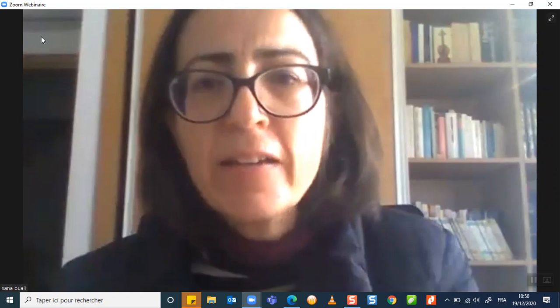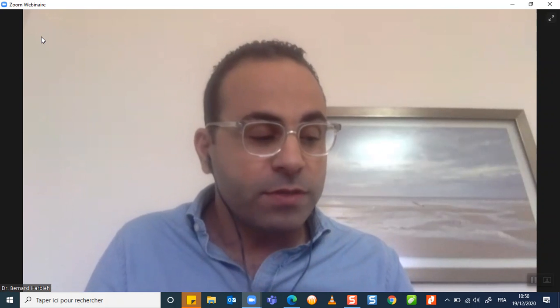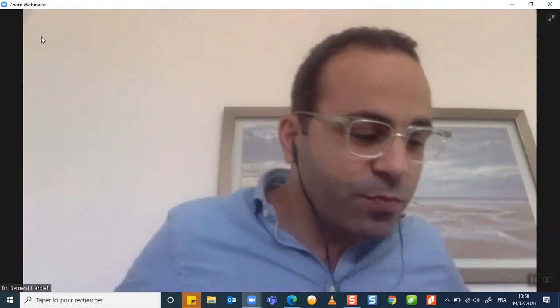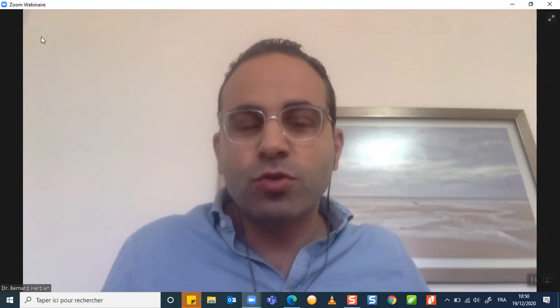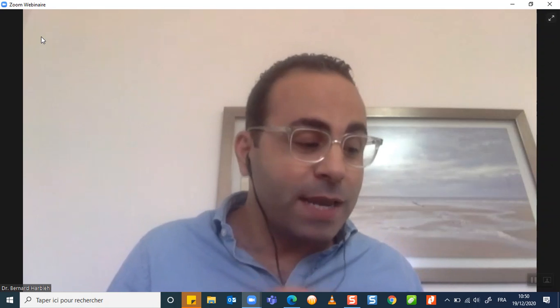Thank you, Doctor. I just want to make one comment, because this is a very important comment for the PRAETORIAN trial. They said, okay, we were expecting such results, but we had a bit higher percentage of inappropriate shocks than usual. If you dig more into the PRAETORIAN trial, you can see this is mainly related to the fact that 50% of the S-ICDs implanted were older ones, and 80% of the devices didn't have the SmartPass option. Maybe this is one of the factors explaining why the percentage is a bit higher than usual.